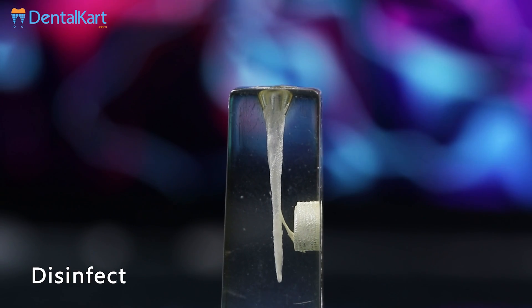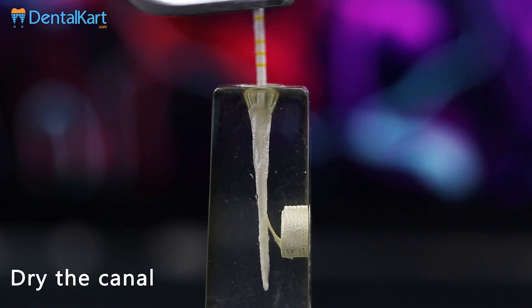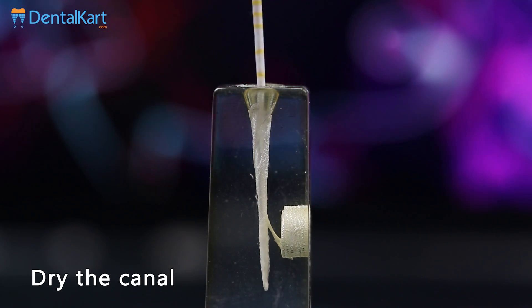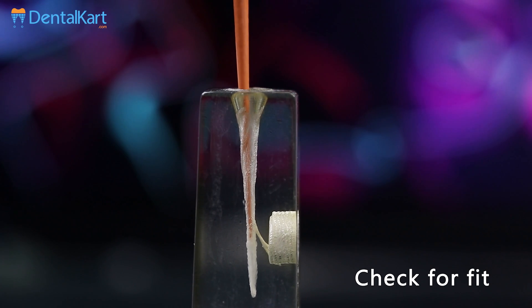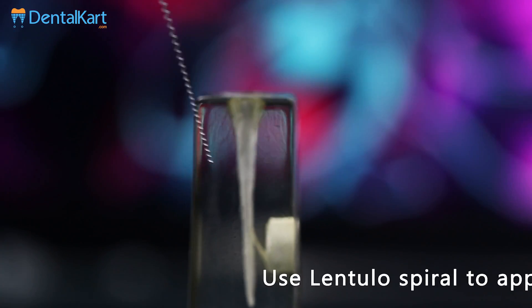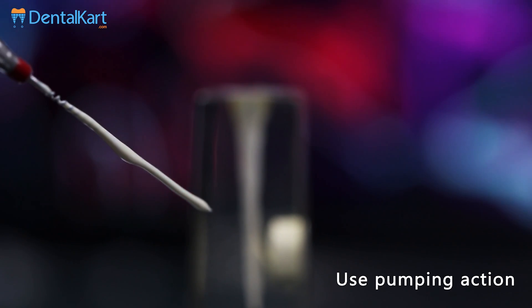After the biomechanical preparation of the canal, disinfect and dry the canal completely. Check the master point fit into the canal. Use a lentulo spiral or reamer to apply Sealpex into the canal, avoiding overfilling as it hinders proper gutta-percha placement. Place Sealpex by pumping action of the lentulo spiral.